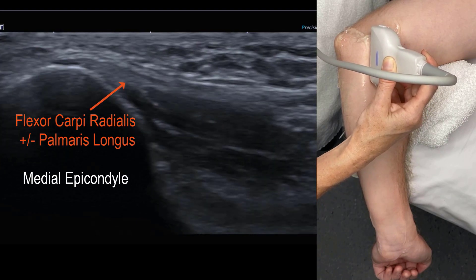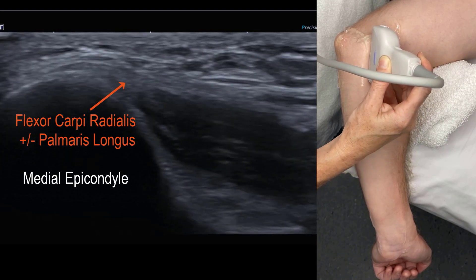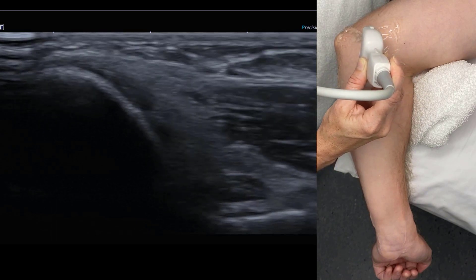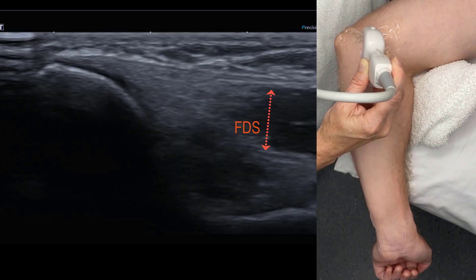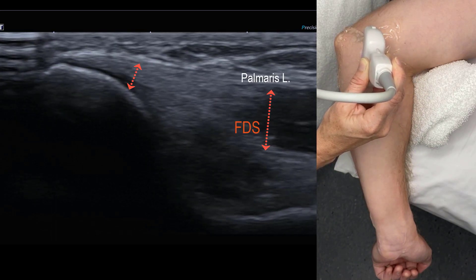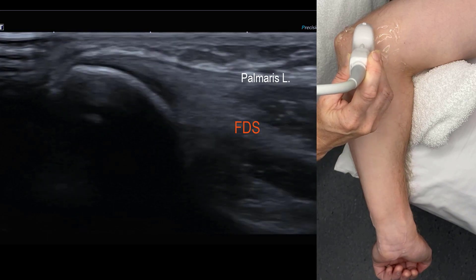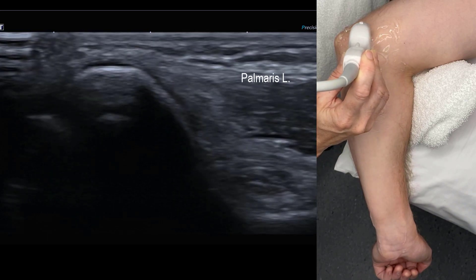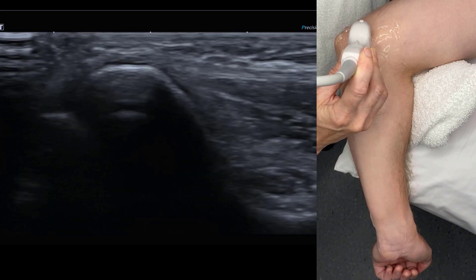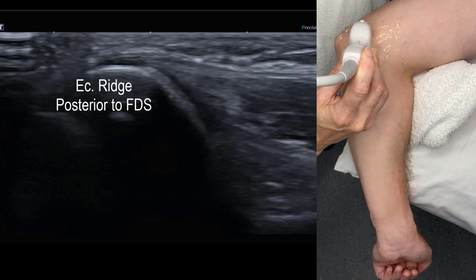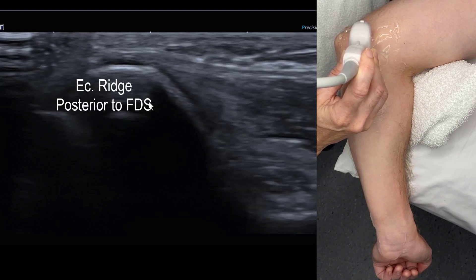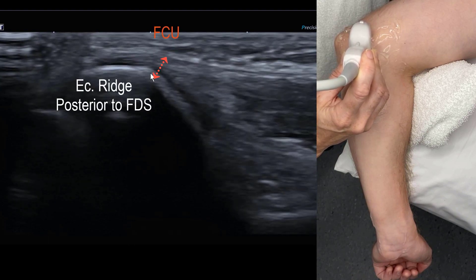From anterior to posterior: FCR first, then we move on to the central third — this is FDS — and now we move posteriorly towards the olecranon and can tilt in from that posterior aspect to fall onto the flexor carpi ulnaris.